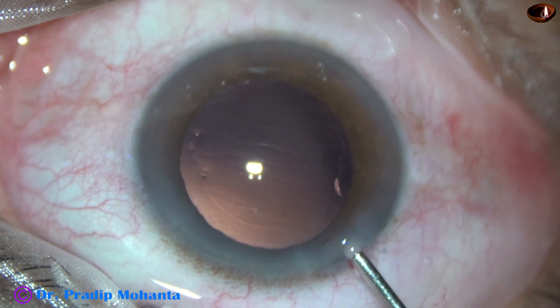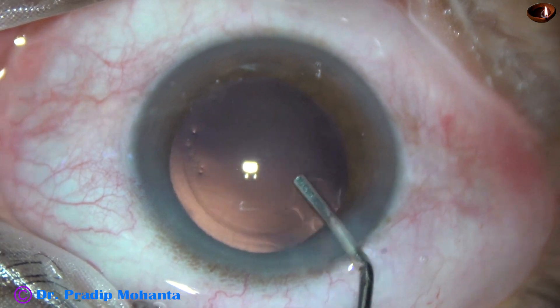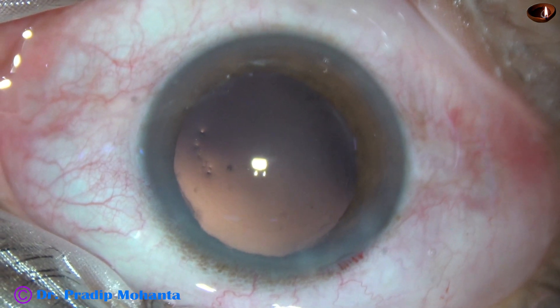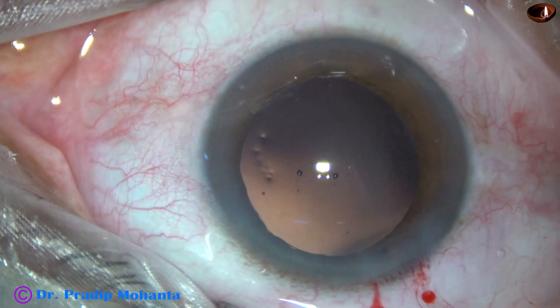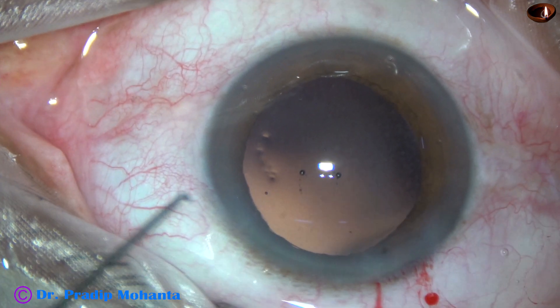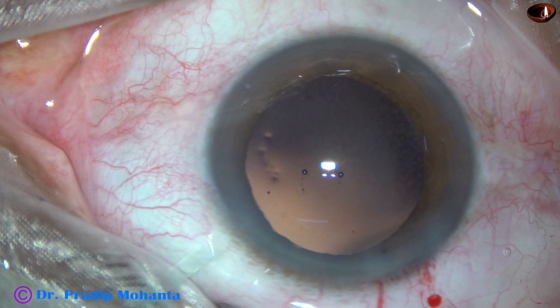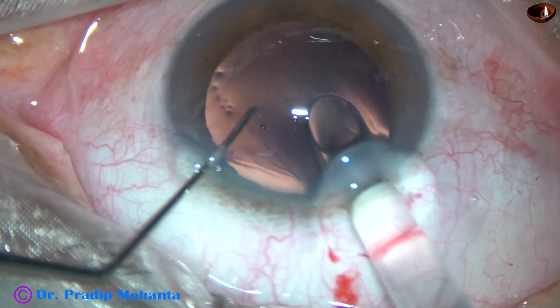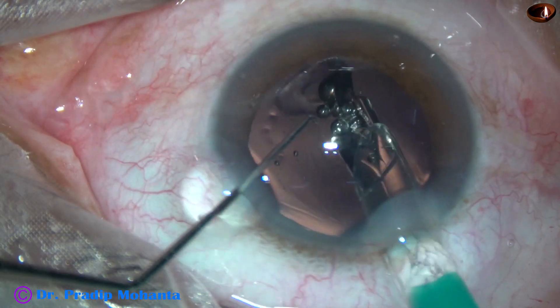And now the anterior chamber and capsular bag is filled up with 2% HPMC. And then a hydrophilic acrylic single-piece monofocal intraocular lens is being placed in the capsular bag.